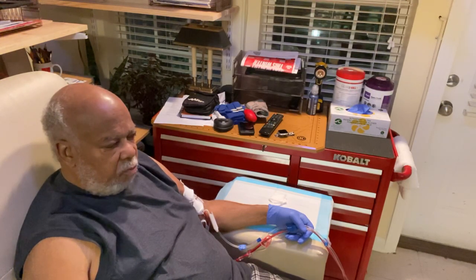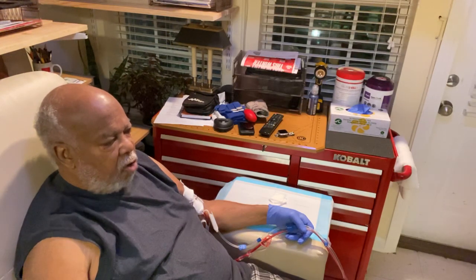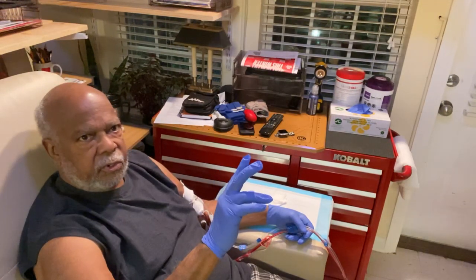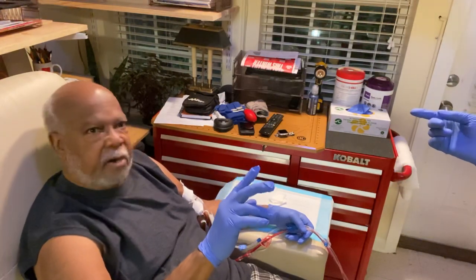At this point, we will be running our treatment for — not approximately, but for three hours. So we'll see you at the end of our treatment.